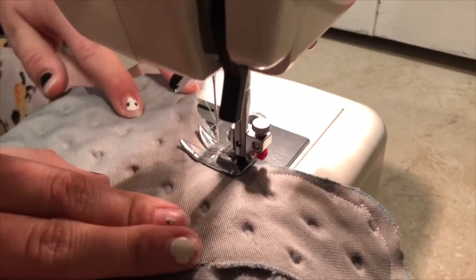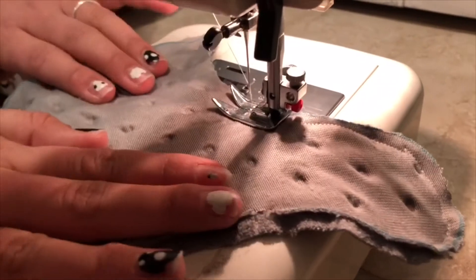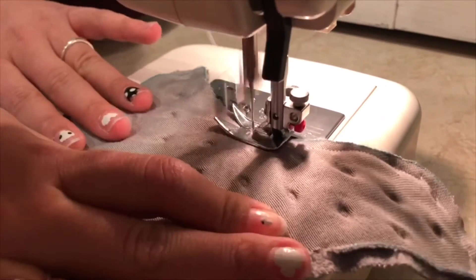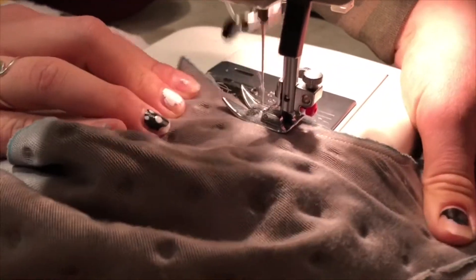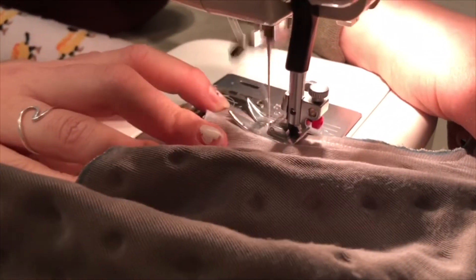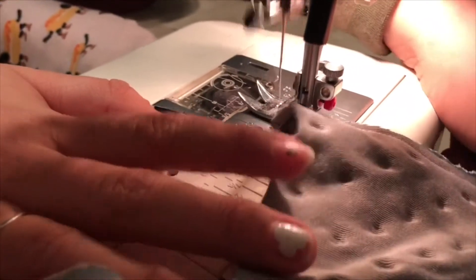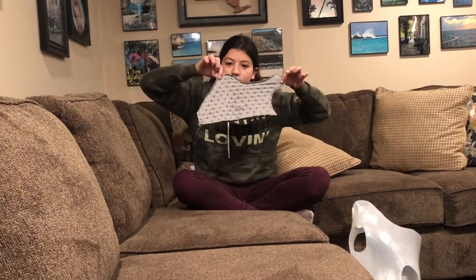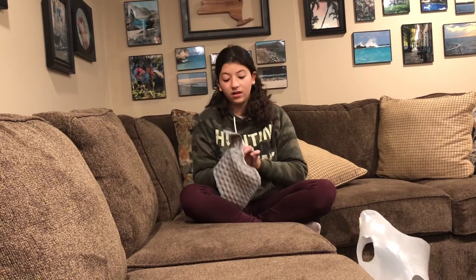Okay, so we're almost done and I just have to remove my last pin. It took me about five minutes — not too long. Now we have the piece and it's sewn into this shape. Now we're going to flip it inside out and see the final product.